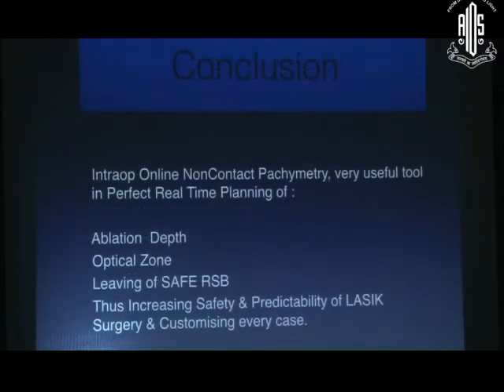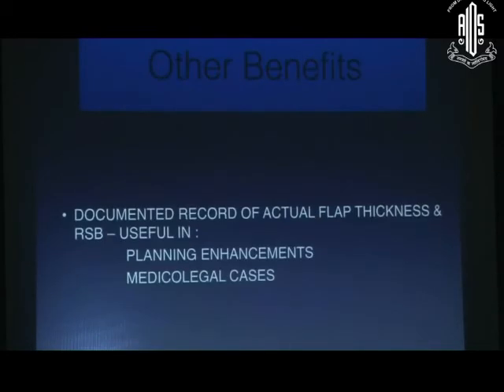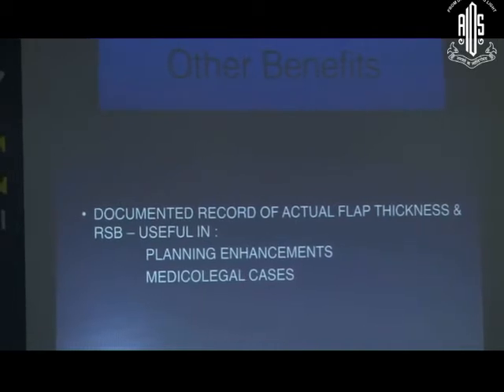So the other benefits of the online pachymetry is that you can document the residual stromal bed, which is very important when you are planning enhancements, as well as in medico-legal cases, so that in case you have a problem later, you know what the actual stromal bed left behind was.